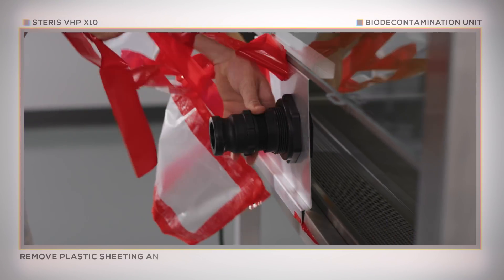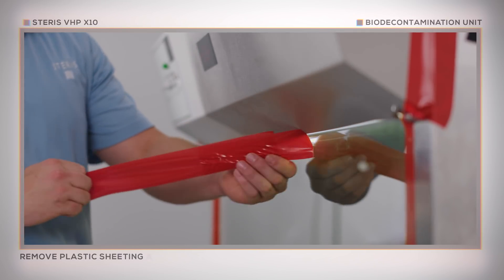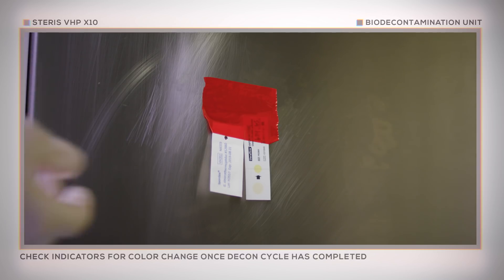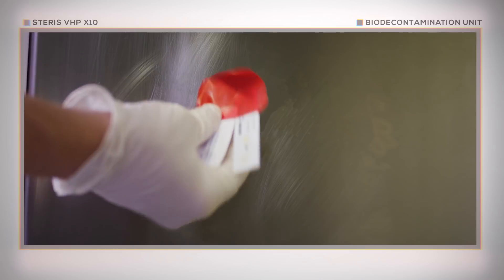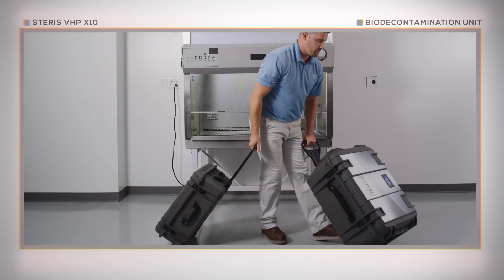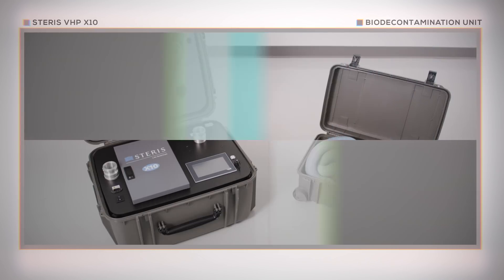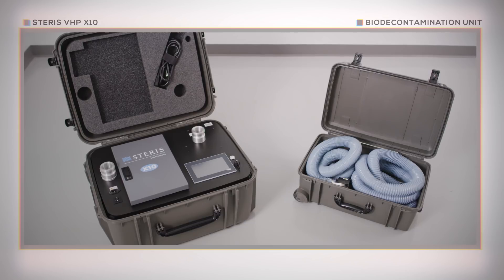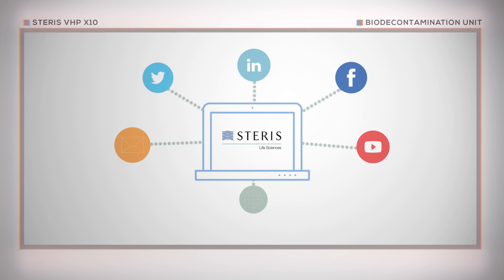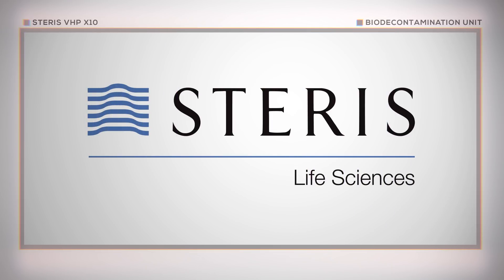The plastic sheeting and tape, along with any tape residue, should be removed. Operators should also remove any chemical or biological indicators that were placed inside the biological safety cabinet. Power down the X10 unit and then remove the power cord. Pack away all components in the accessory case and then disassembly is complete. The Steris VHP X10 Bio-Decontamination Unit is designed to provide years of reliable service. For questions or information on additional product offerings, please contact your local Steris representative or visit us online at www.sterislifesciences.com.